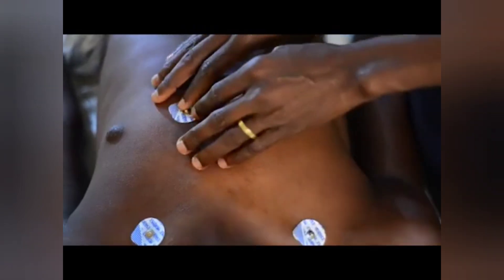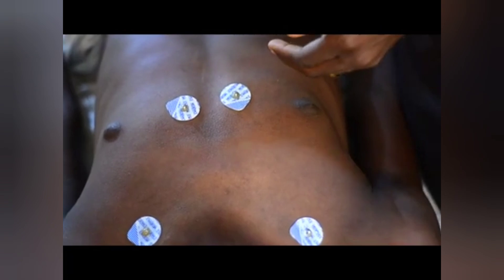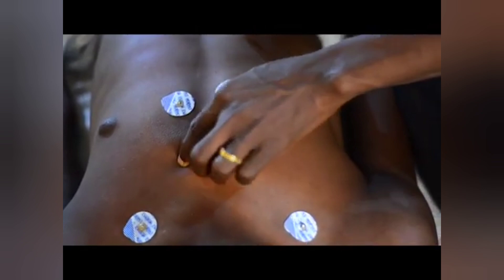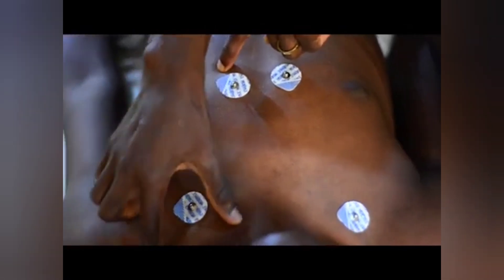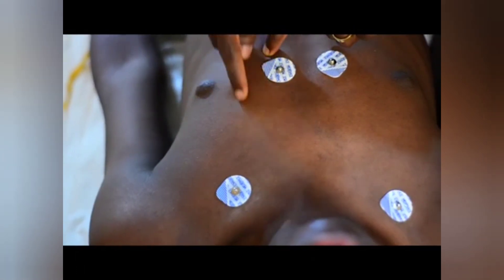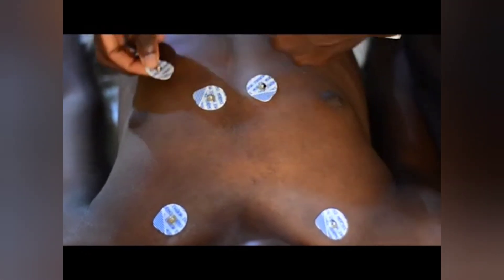We will skip V3 for now. V4 is located on the mid-clavicular line of the fifth intercostal space. Starting again from the manubrium: second intercostal space, third, fourth, fifth intercostal space. The mid-clavicular line is the midpoint of the clavicle — imagine dividing the clavicle in two and drawing a line down. Where that line meets the fifth intercostal space is where V4 is placed.